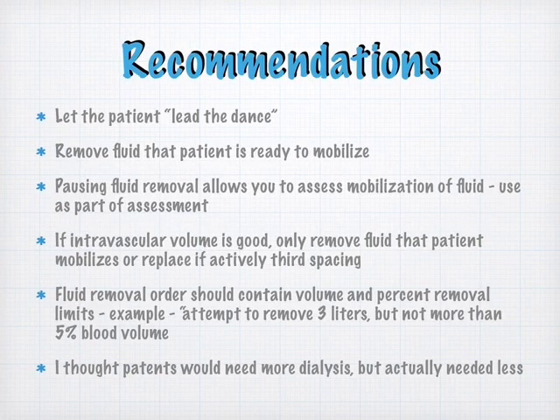So my recommendations then, I guess, are that if you have a device, well, first of all, I don't know how I knew what fluid to take when I didn't have the device. I became addicted to it because I felt like I may as well have run dialysis blind, trying to take fluid off patients when I had no idea whether they were third spacing or whether they were recruiting. So I guess the message to me was just let the patient lead the dance.